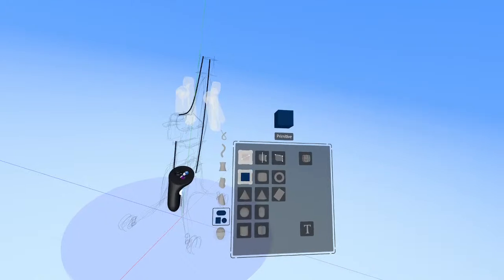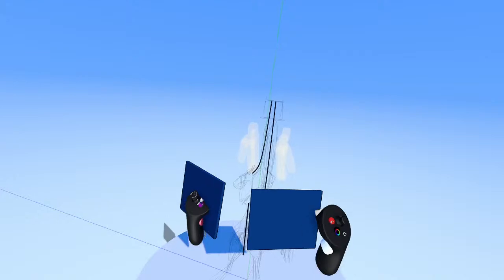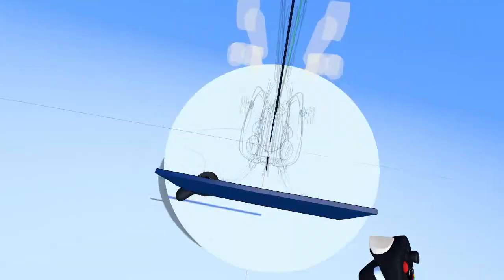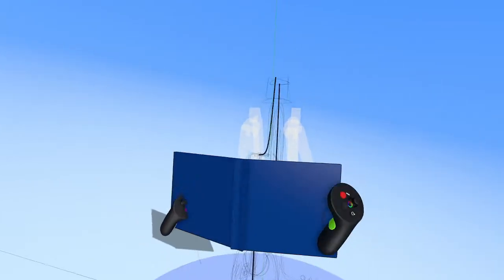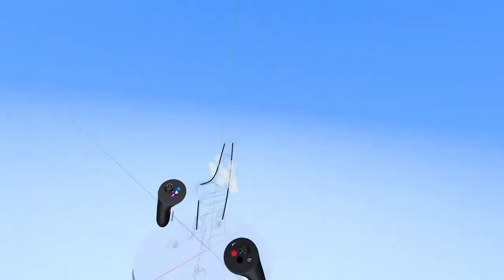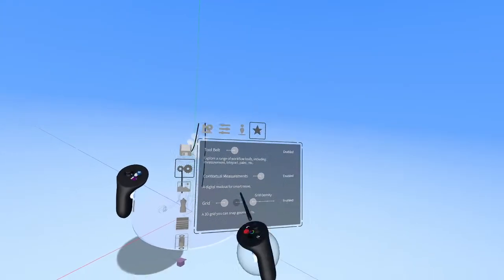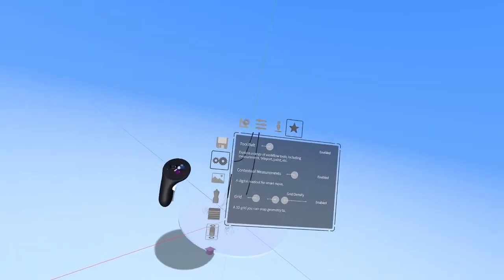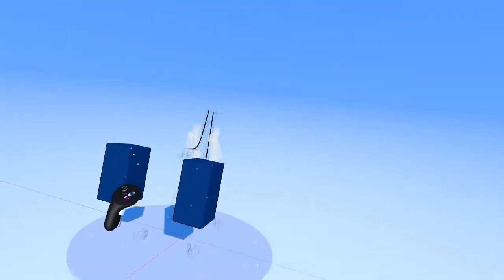So we're going to go to primitive shape, cube, and I'm going to show you another pretty useful feature here. If we just go to primitive shape and select cube, we can make something kind of the size of a screen, right? And we want to place it exactly along the center line, but actually, that's pretty good. But you'll see it's not precise. It's really tough to place a primitive shape precisely in the space. So what we'll use here is another beta feature: settings, beta, grid tool. So let's turn on the grid. And once you turn it on, you see all these floating dots around. That is the grid. And then you can click and drop in a shape very easily, and it's placed very precisely.